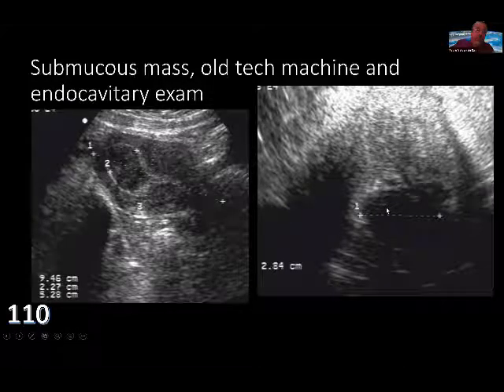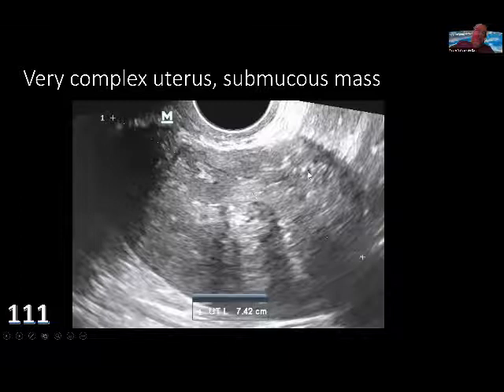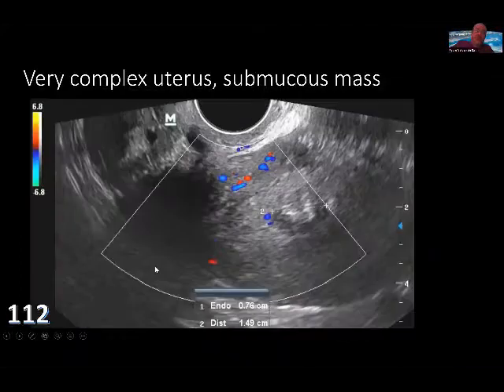The same mass, 2 point something inside, probably a submucous fibroid. And a very complex thing inside the endometrial cavity. With no significant color Doppler findings.